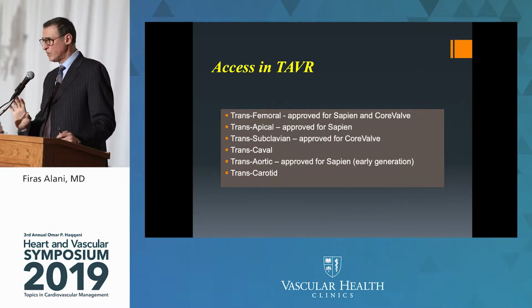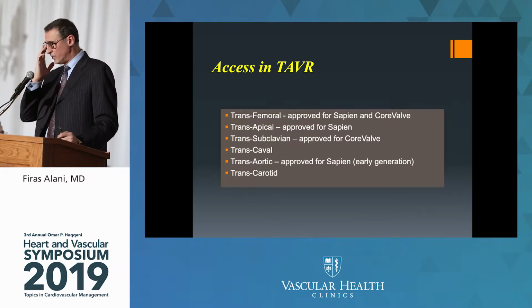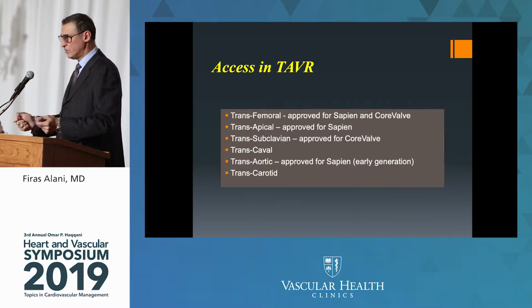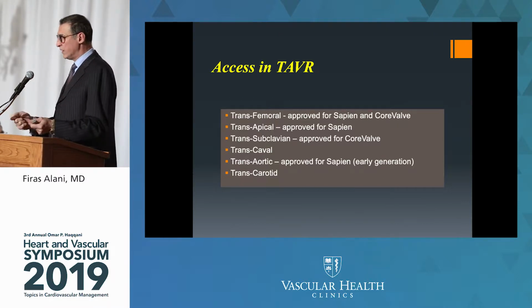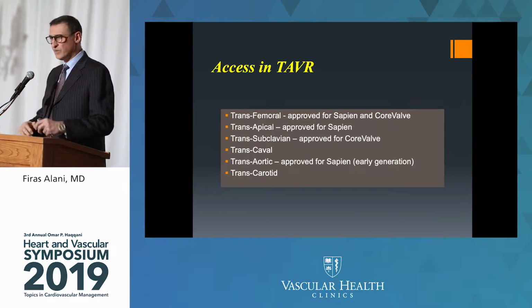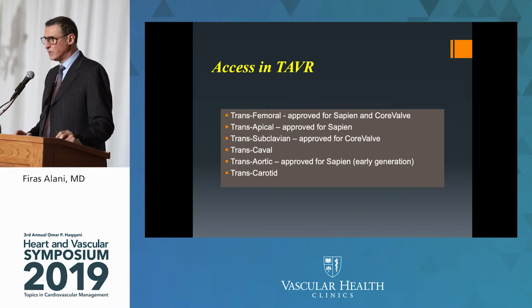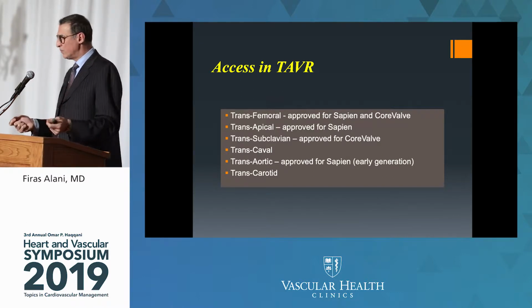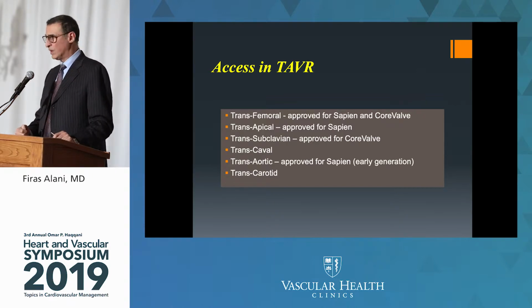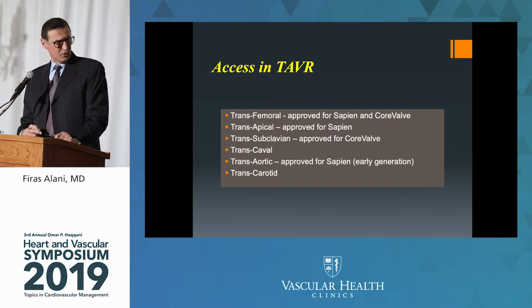Again, I want to say one of the most beautiful things about this procedure is the harmonious dynamics that you see between the interventional cardiologist and the CT surgeon. This is a therapy that truly is offered by both experts. CMS has recognized this, and all the billing has been adapted to that. This is a hybrid approach. This is not a one-man show. This is not a unilateral decision. And the surgeons are true partners in these procedures.